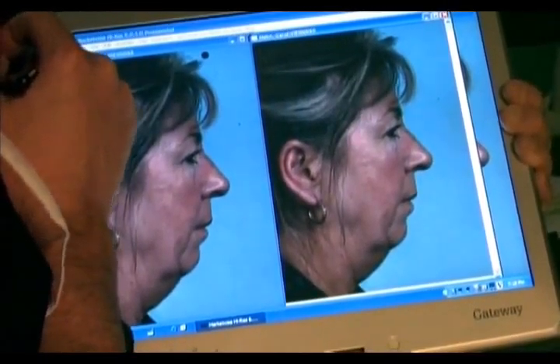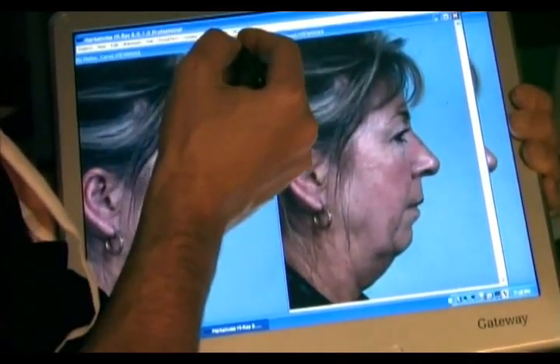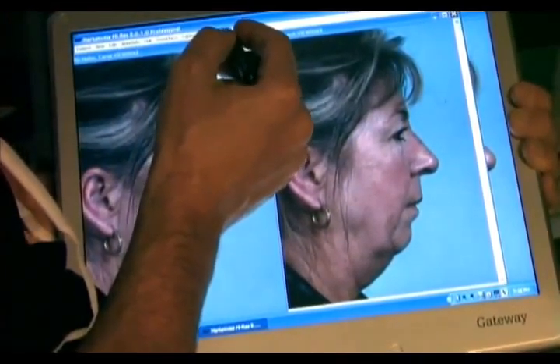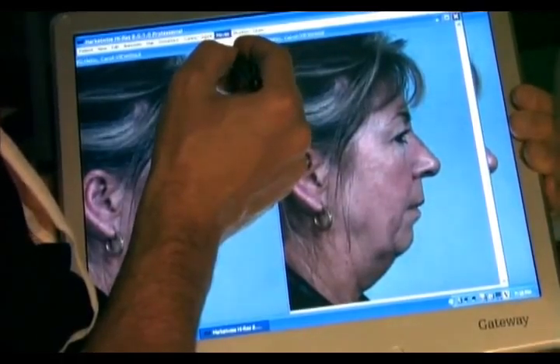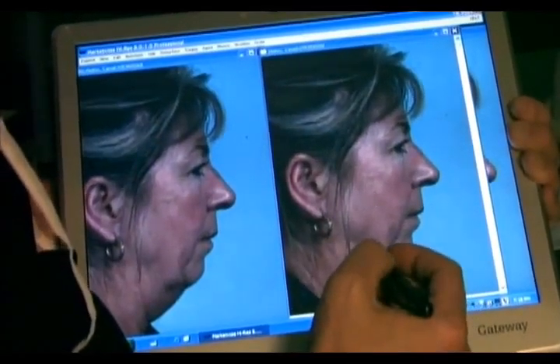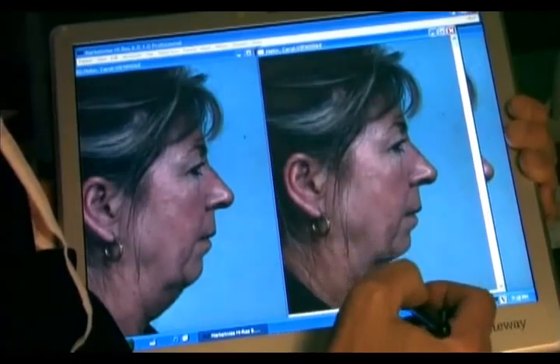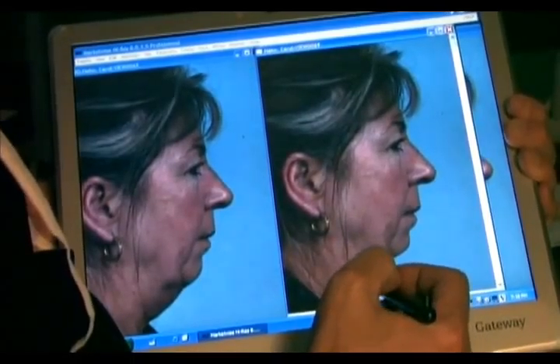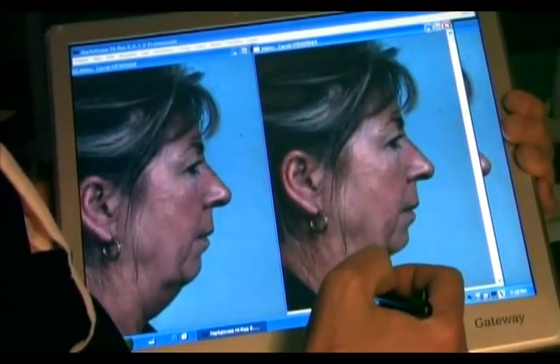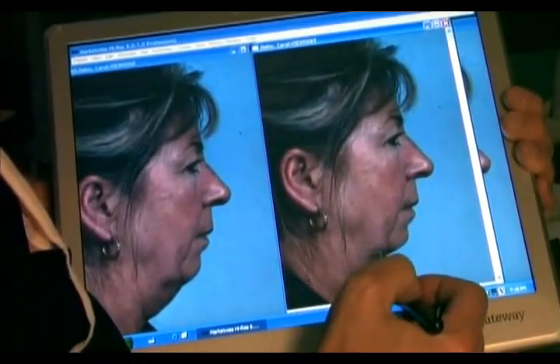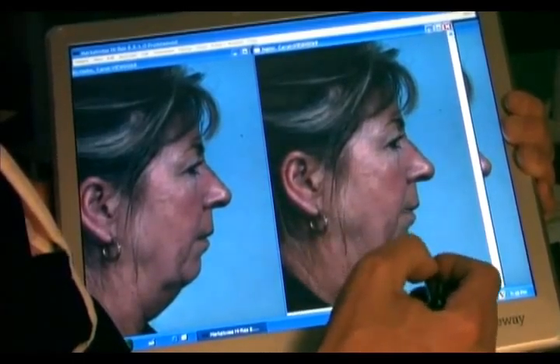One of the things we do with computer imaging is I'm able to morph the face to show you what's possible, but also to understand what's important to you. This is an area where we can discuss what you want to achieve and I can tell you what's possible. I'm not going to tell you I can do something I can't — I'll show you what I think is real.